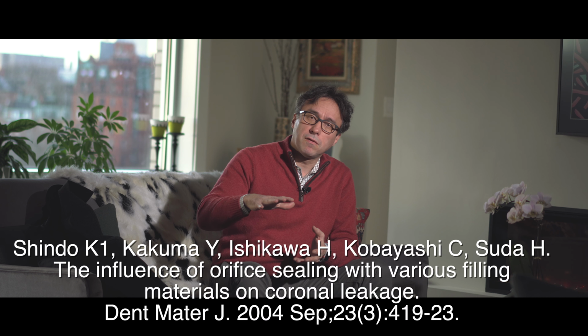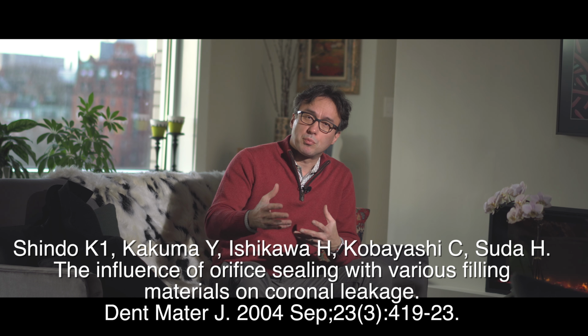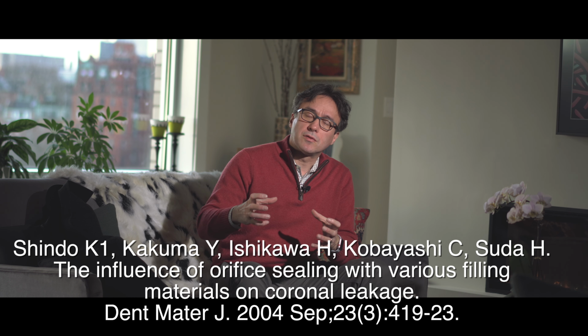Now, where the BC liner comes in here is as a provisional liner, as a canal cap that you could place on top of the root canal therapy tooth on the furcation floor or immediately over the gutta percha, where the sensitivity of leak is the most prevalent. By placing this bonded restoration on top as a canal cap, you can improve the seal.